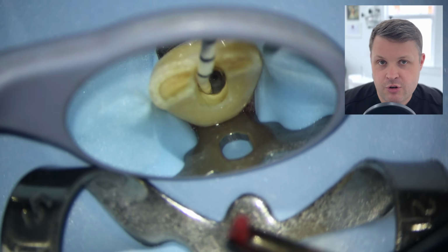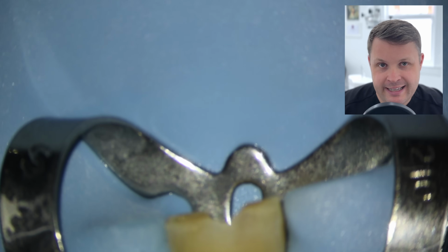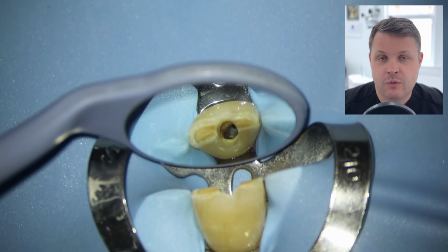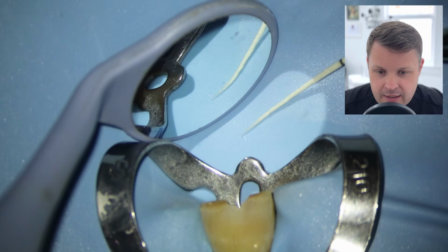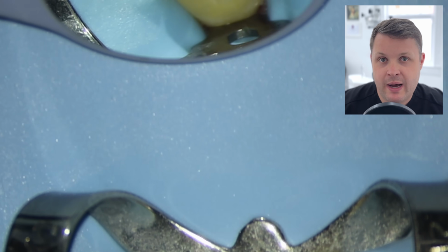And then we're just going to dry the canal with our paper points, and I'm going to make sure that the canal is completely dry before we fill this. Obviously, because the sealer won't work very well if the canal space is really, really wet. And then before we obturate the main canal, I am going to do our perforation repair.